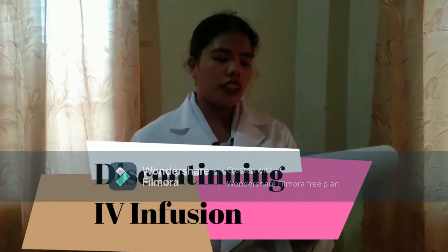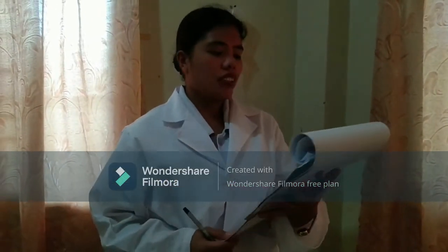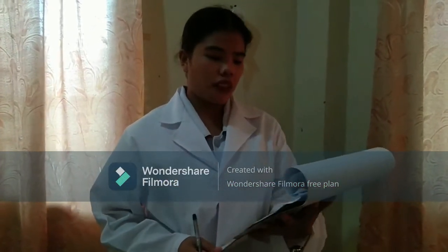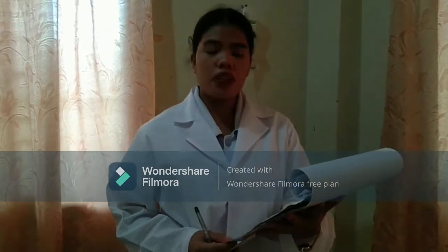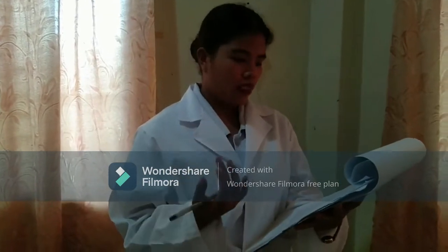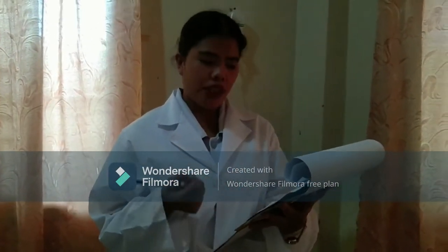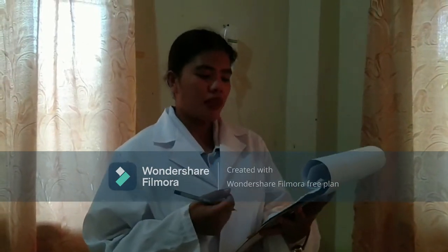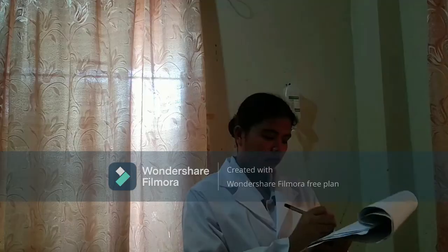Next is discontinuing intravenous infusion. The indications for this are: the client's oral fluid intake and hydration status are satisfactory so that no further IV solutions are ordered; there is a problem with the infusion that cannot be fixed; and lastly, the medications administered by IV route are no longer required.